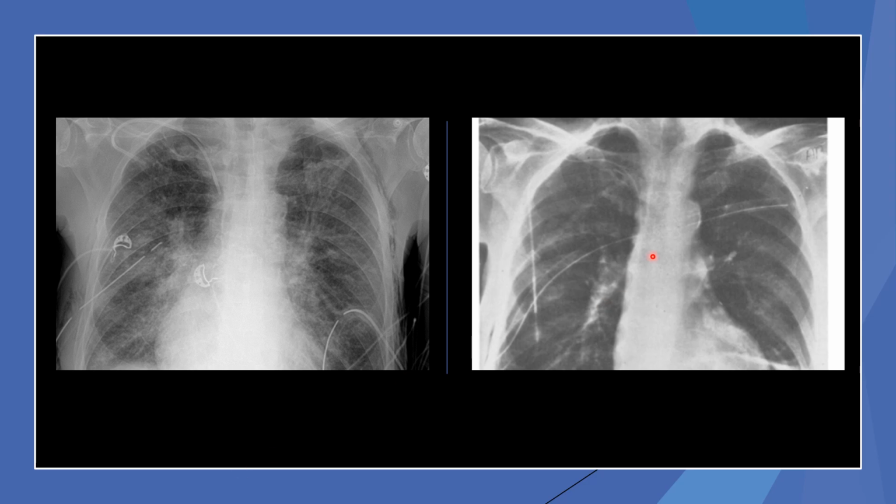Okay, these two chest x-rays here are prime examples of misplaced chest tubes. When we look at the one on the left, look how it's not very far in. That pneumothorax is sitting high up and in here. That chest tube's here. Now this could either have been from the insertion itself, or this could be when the patient moves and it's partially pulled out.